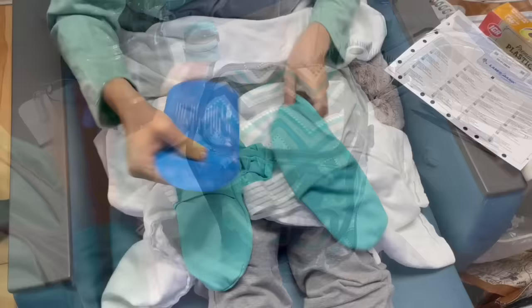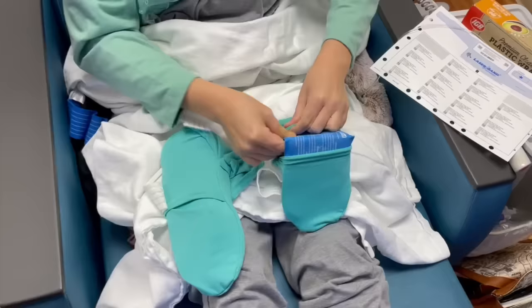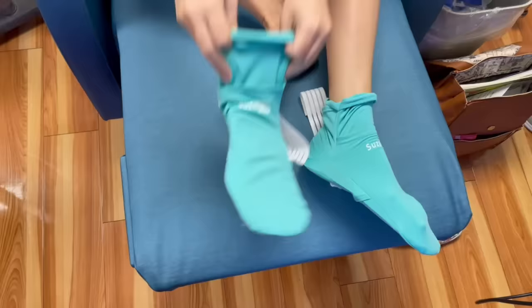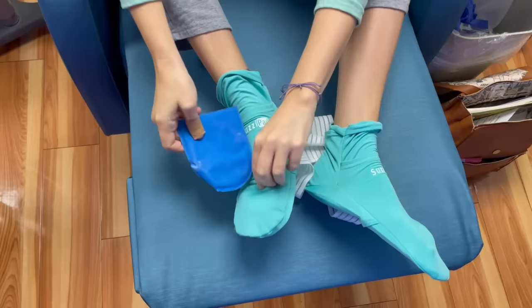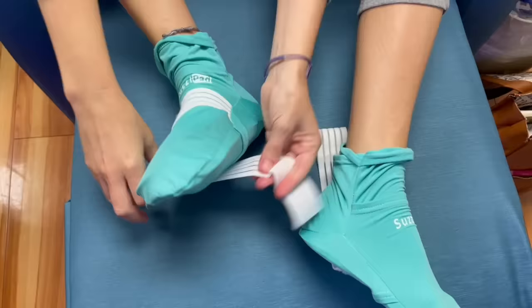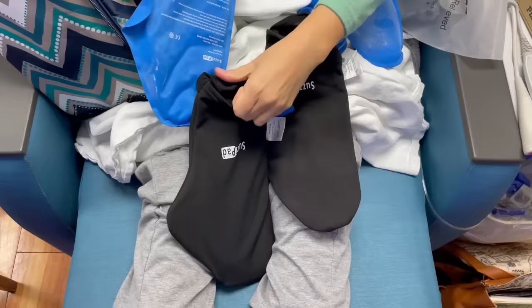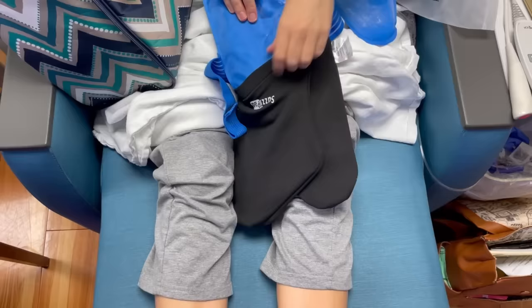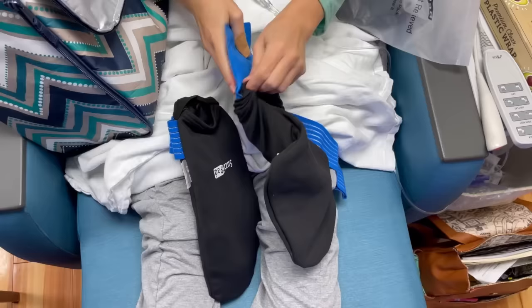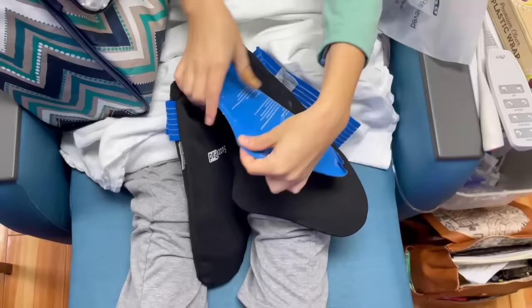Now that we are at the infusion center and my pre-meds are over, it's time to go ahead and get the socks and mittens ready to go. You just put the ice pack in the bottom of the sock — there is also a spot on the top of the sock where you put another ice pack — and after you get those all situated and set up, you go ahead and just strap them onto your feet. With the mittens, the same thing: put the ice pack in both sides of one mitten, so there should be two ice packs per mitten — one on the top and one on the bottom side. Slip them in, get them ready to go, then slip them on your hands and strap around your wrist to keep them secure and in place.